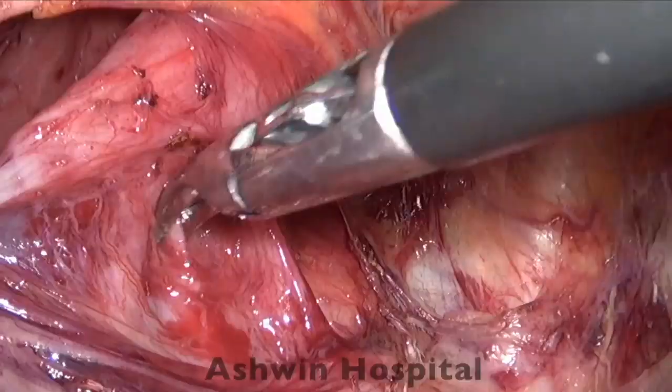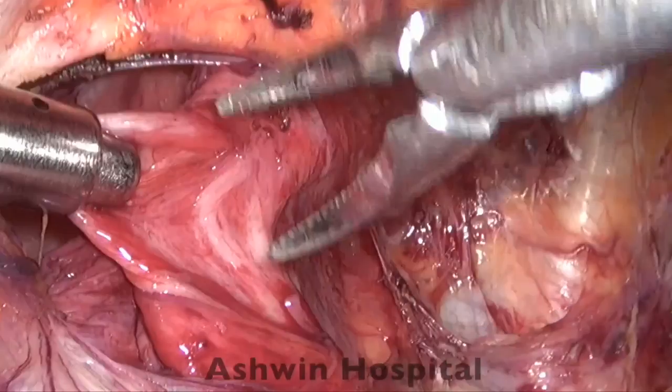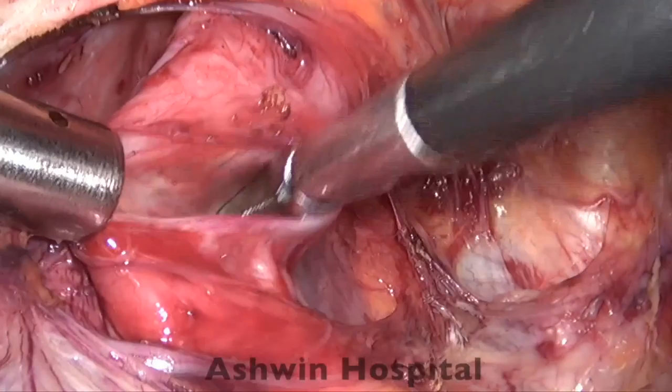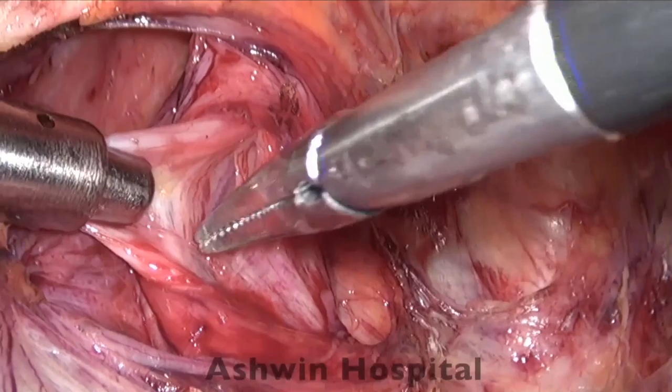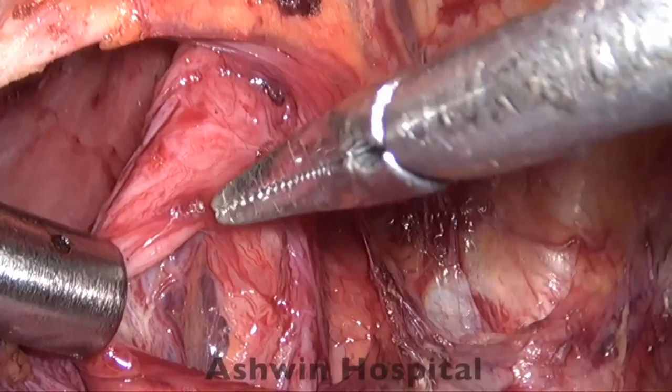So here this is just a case of indirect hernia, which is showing you how to dissect the indirect sac. Once again, we identify the edge of the hernial sac, you hold it with one instrument, and then you slowly tease off the tissues. You can see the testicular vessels and vas coming very close to it. So you keep teasing the tissues, and then we will use a short burst of cautery whenever there is a requirement. So when there is a small fascial attachment like this with a little bit of a branch or a vessel, then you can use a short burst of cautery and again tease the testicular vessels away from our dissection.